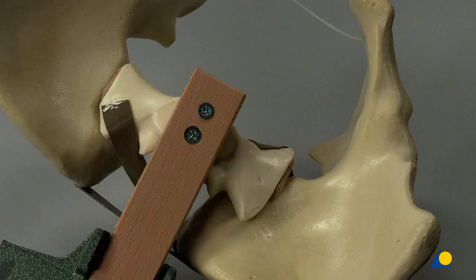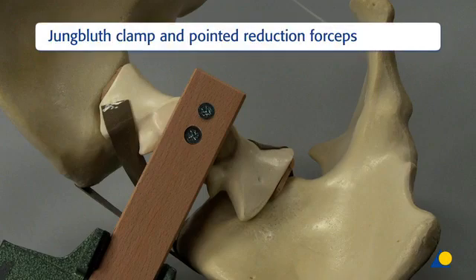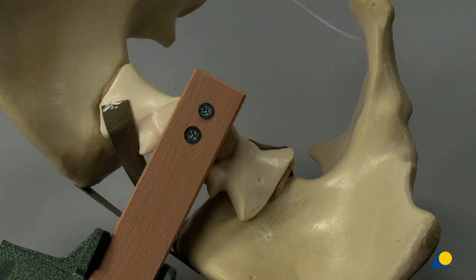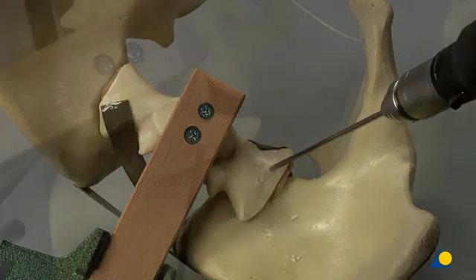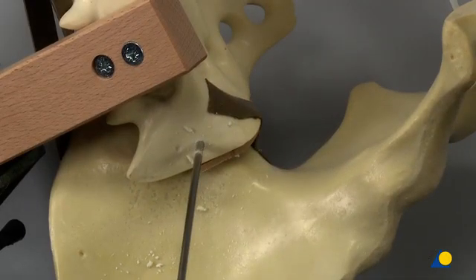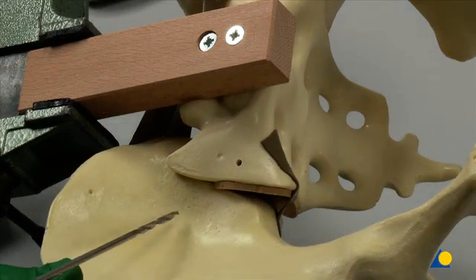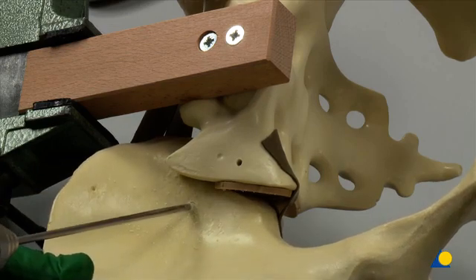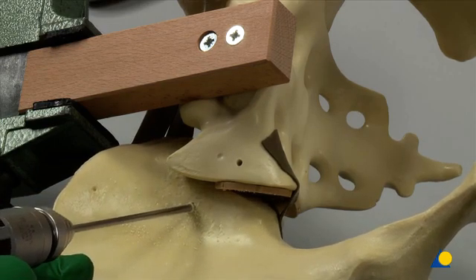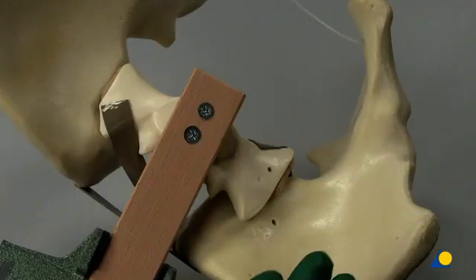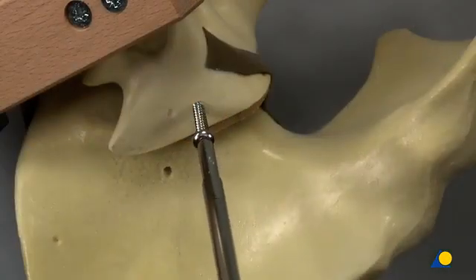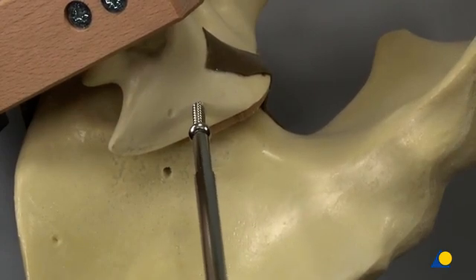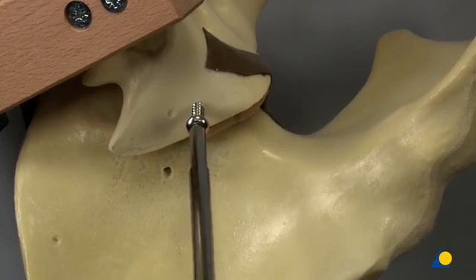Different reduction techniques. Reduction using a Jungblut clamp and the pointed reduction forceps. Expose the lateral part of the sacral ala and drill a 3.2 mm hole respecting the spatial orientation of the sacro-iliac joint. The position of this hole should allow later plate placement proximally and distally to this anchoring screw. Make a second hole in the iliac bone close to the sacro-iliac joint. Insert two 4.5 mm cortex screws of appropriate length.